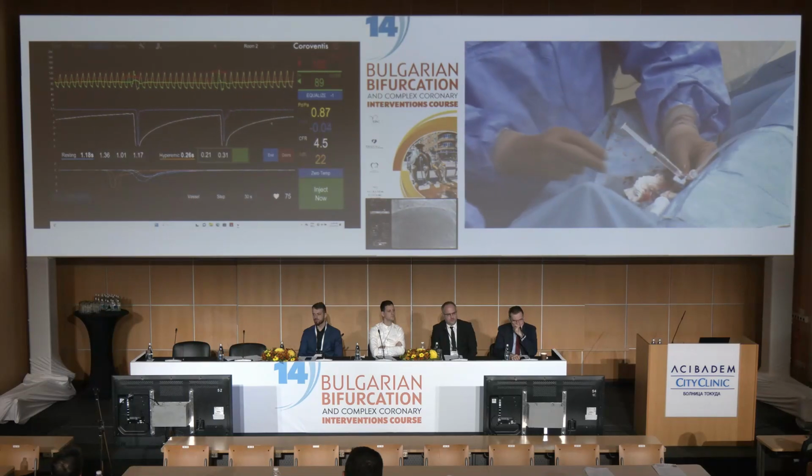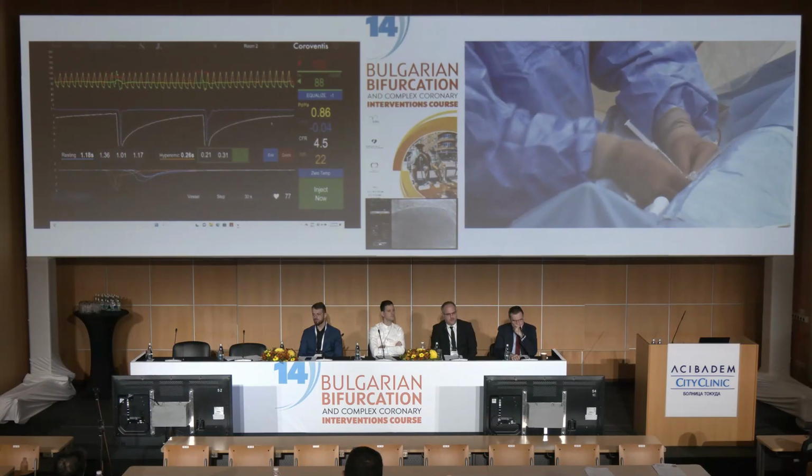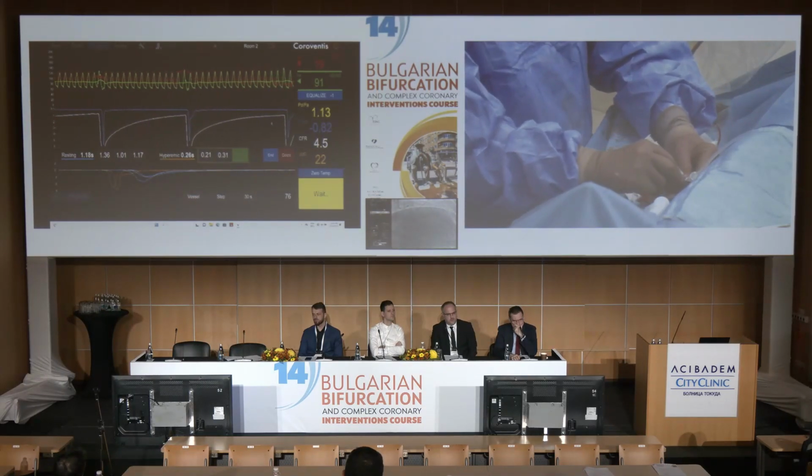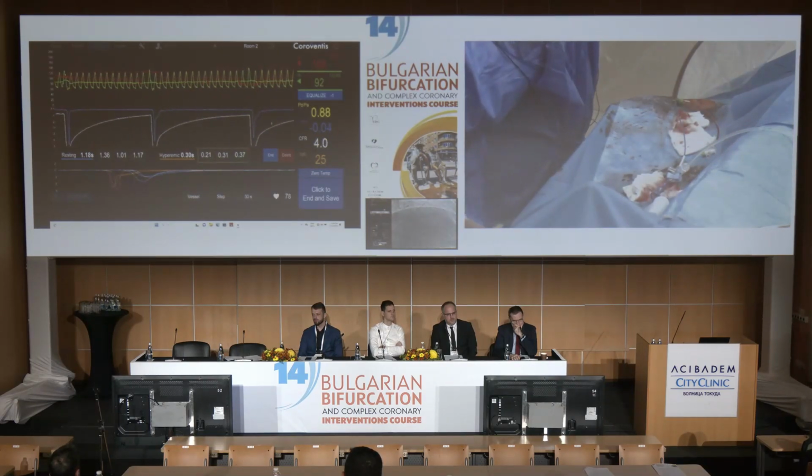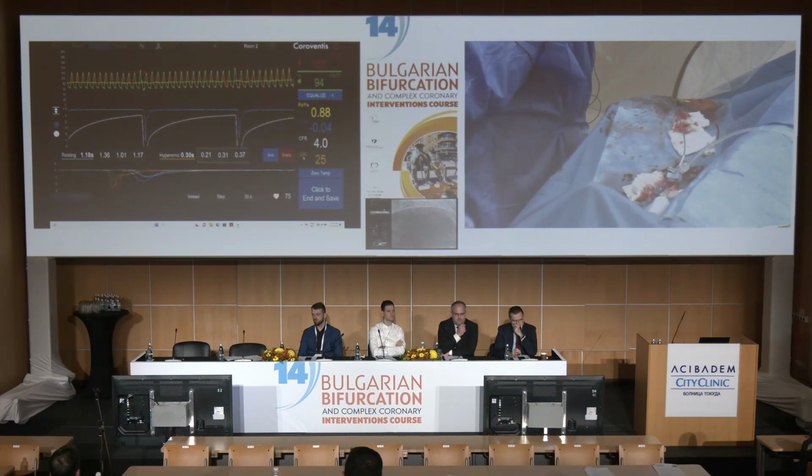And we will stop once you inject. Okay, that will be a little bit longer. And we are going to stop. Click and save. We can click and save.